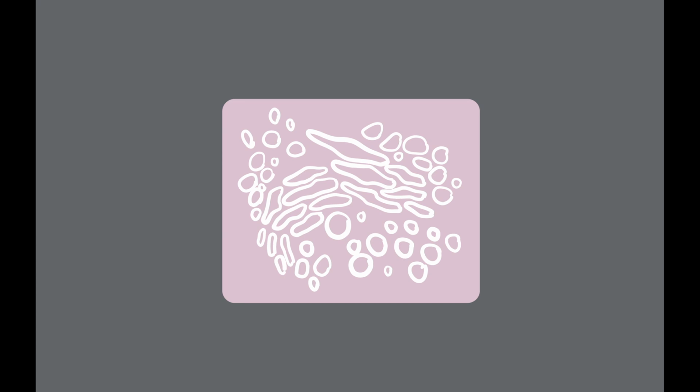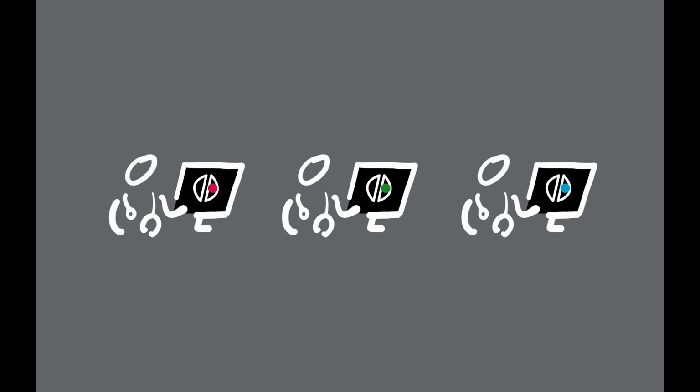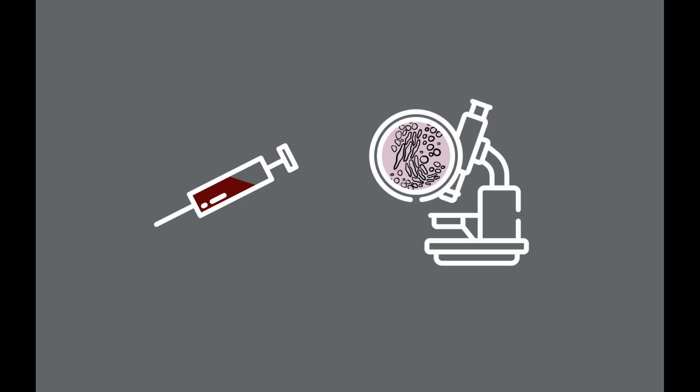With our advanced diffusion MRI methods, on the other hand, we allow clinical researchers to identify new imaging biomarkers invisible when using conventional methods. We believe that such biomarkers have the potential to replace unnecessary invasive procedures, such as contrast agents and biopsies. So, how did this all start?